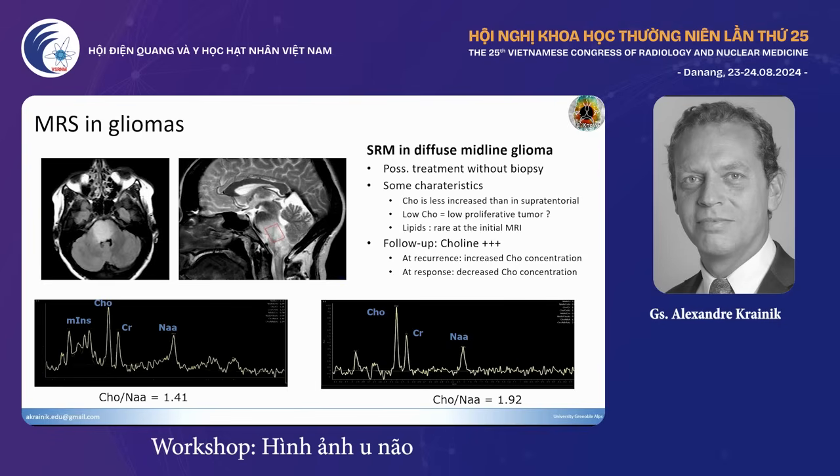Then, when we are lacking the pathological diagnosis, we rely on spectroscopy, of course, on morphology and so on, but also on the spectroscopy that demonstrates the high content of choline and the lack of NAA, which is really significant to determine these highly probable neoplasias. And using the MRI, they will start using chemotherapy and so on, without any biopsy.